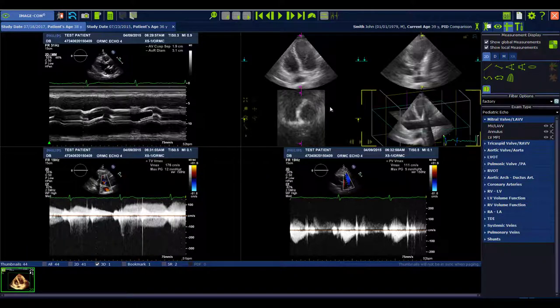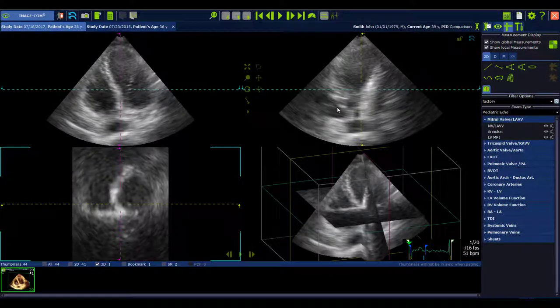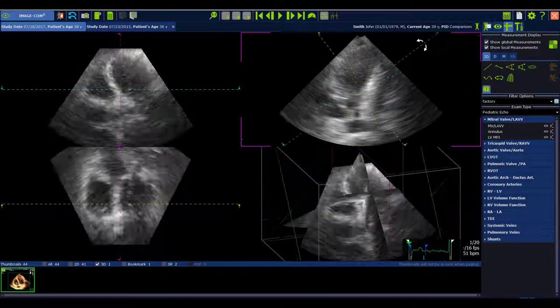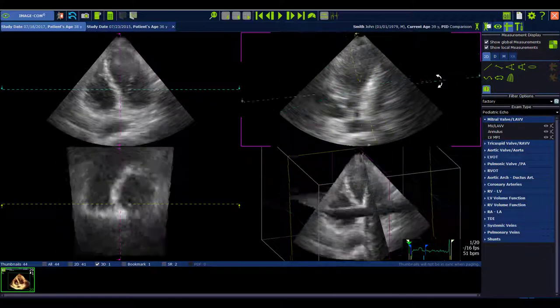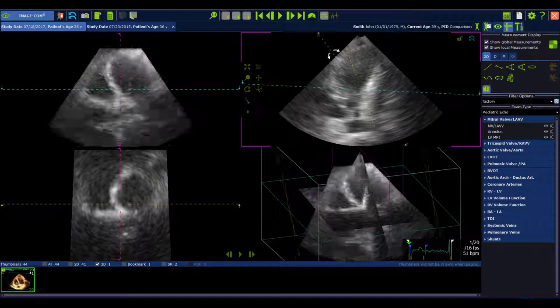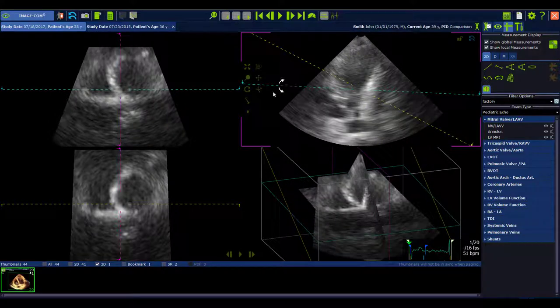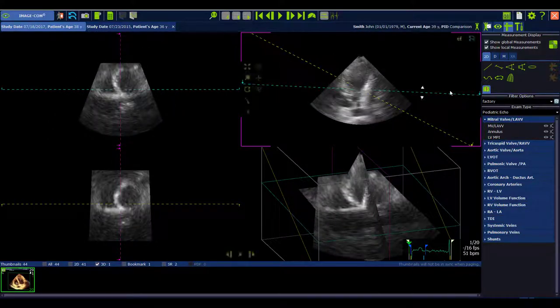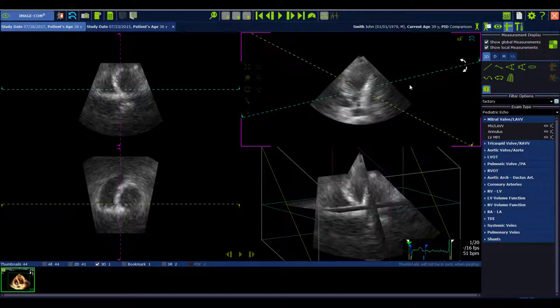For the 3D review in ImageCom, the lines of intersection mode has changed. Previously they were completely fixed to 90 degrees and you could only move them against each other. Now there is a new button for the 90-degree or free mode. In free mode, you can completely move the lines of intersection freely against each other and they are no longer fixed.